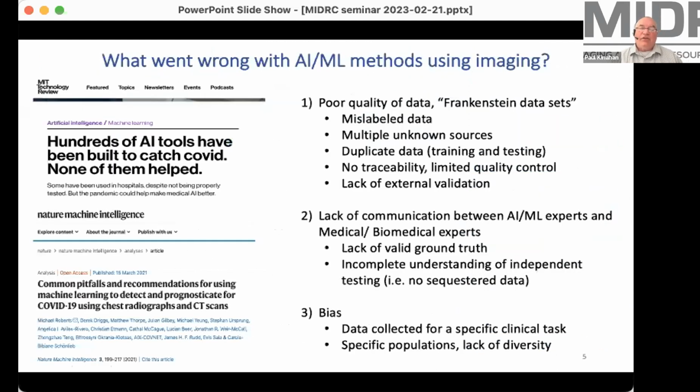So just in case somebody had missed it, it was pretty interesting. About a year after the pandemic, there had been literally hundreds and perhaps thousands of publications using AI tools on radiology imaging. And then the essential meta-analyses came along. The titles of just two of the more influential meta-analyses at that point really point out that none of the algorithms were working or providing useful results that were translatable.